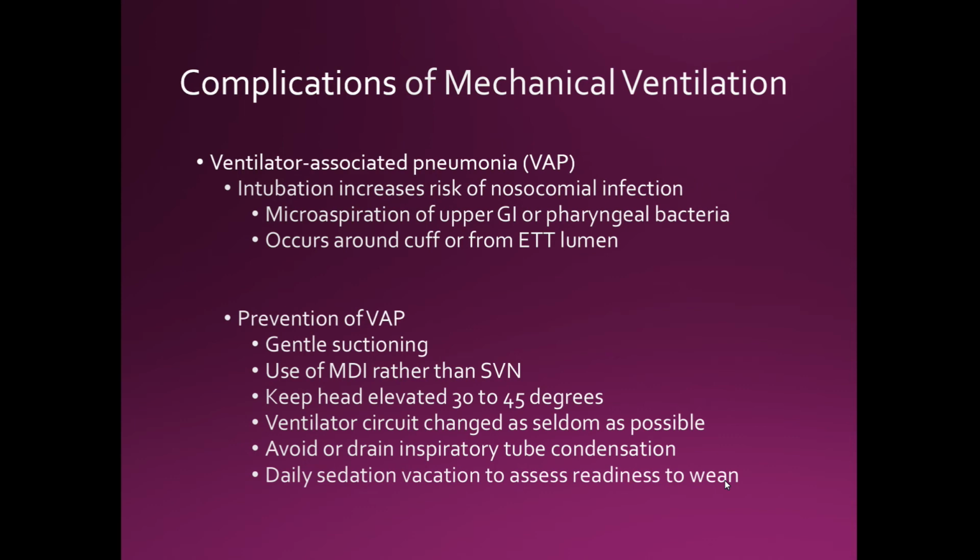Why? Because we have small capillaries running around the trachea. And if we hyperinflate the pilot balloon, we have a high probability that we will occlude these capillaries. Without these capillaries or small vessels, we may have an anoxic event to the point where necrosis starts kicking in.